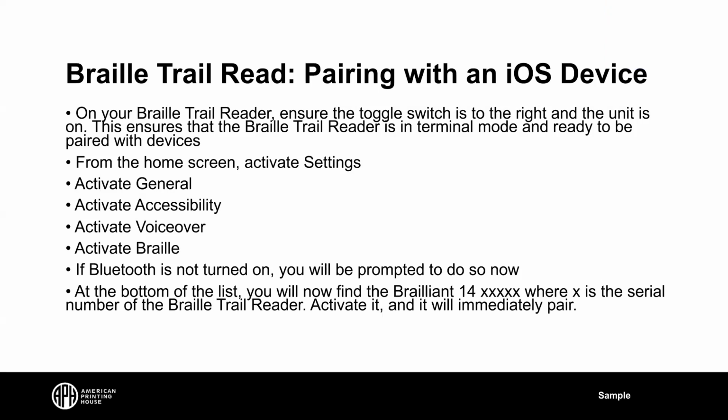Someone has indicated they struggle a little bit with recognizing if the device is off. If you feel spongy Braille cells, it's the only way I can describe it. When we think about any refreshable Braille displays, when they are fully powered off, the Braille display goes somewhat spongy. There is a teeny bit of power providing some raising of the Braille cells, so they're not pulled down all the way. You will feel that they're spongy when you move your fingers across them. And that's always the best way to know if it is fully turned off.